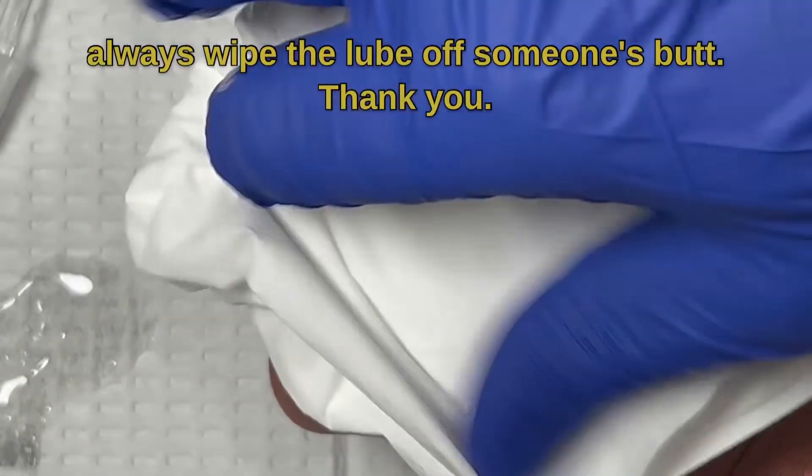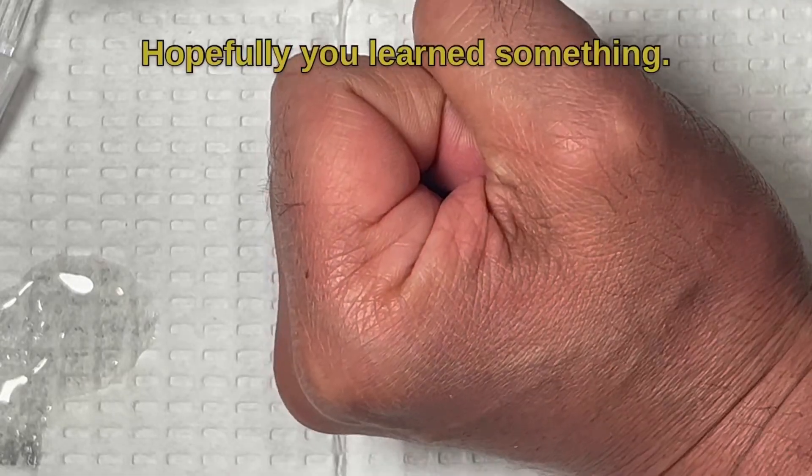Because I'm a good doctor, I always wipe the lube off someone's butt. Hopefully you learned something.